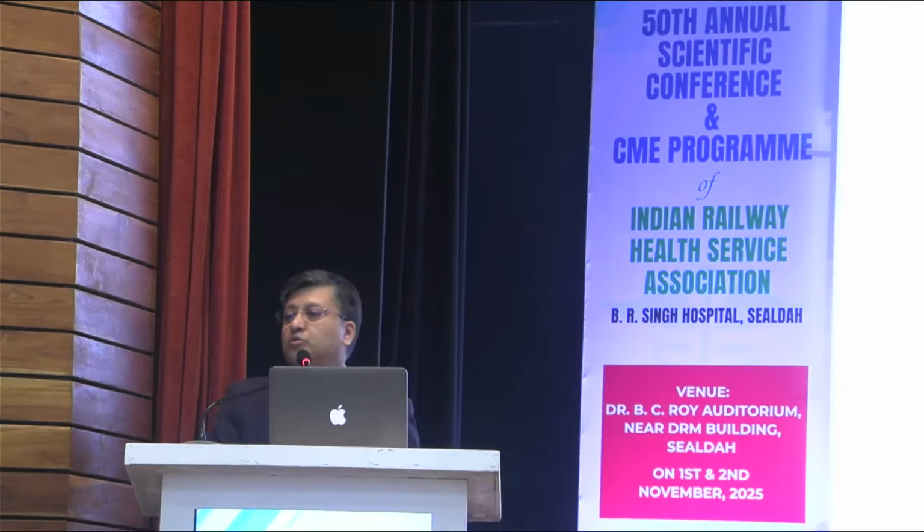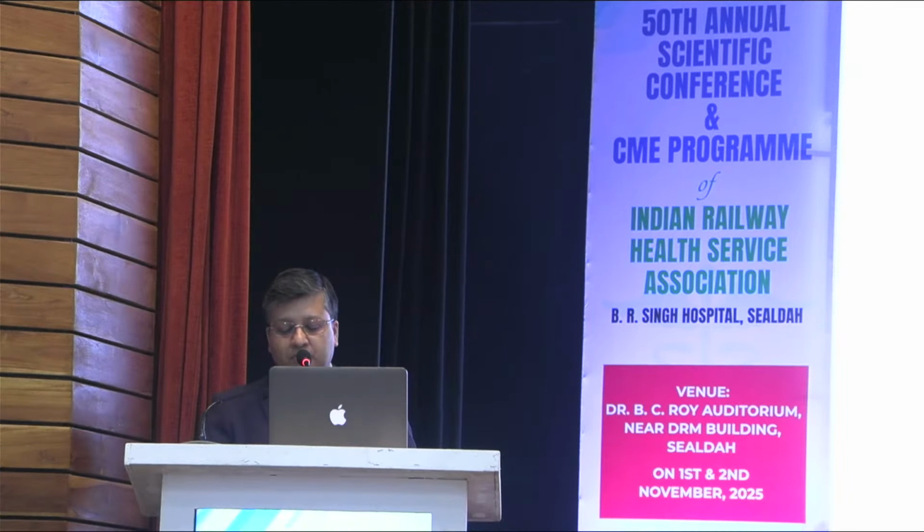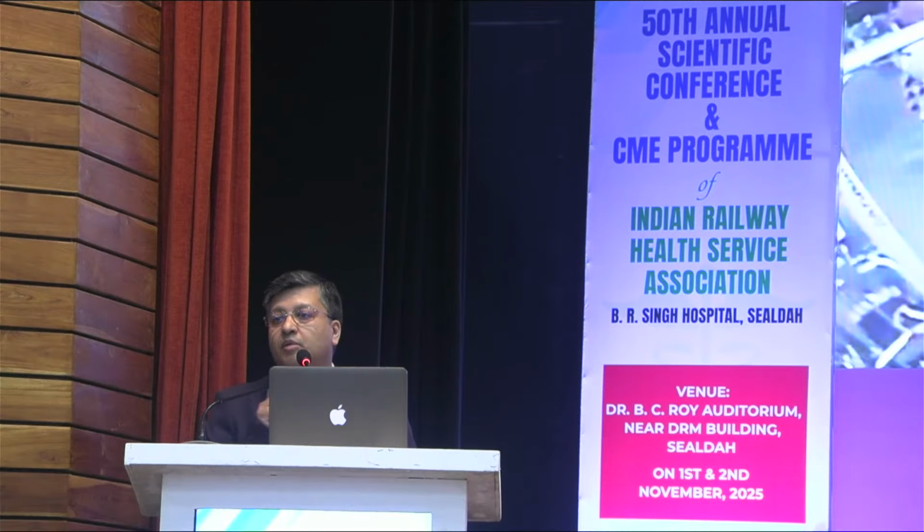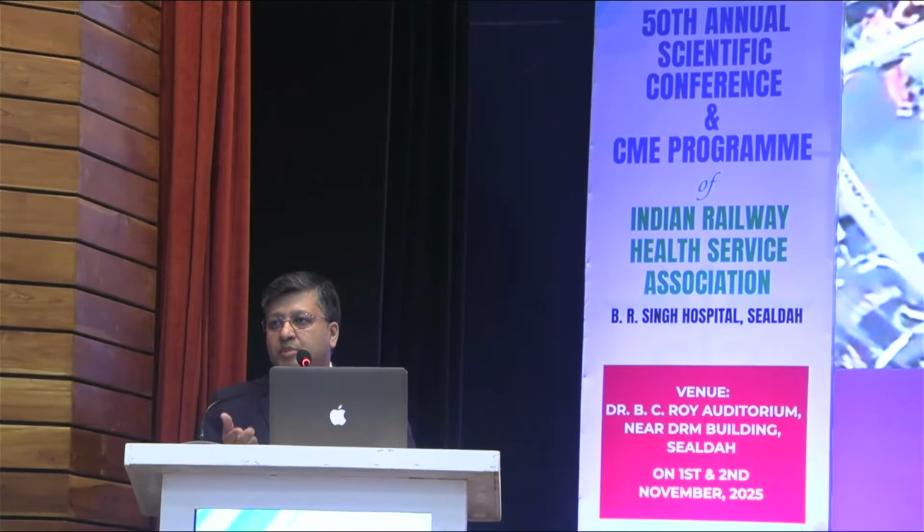Often there are no symptoms, and sudden collapse is the first symptom. Here you can see a very active person who is doing gym, and during gym this 35-year-old lady suddenly collapsed. Only CPR and an automated external defibrillator probably could save her. The automated external defibrillator is automatically charged and automatically discharged; you just have to attach the pads. It will automatically dictate what to do, when to stop CPR, when to start CPR, and by following its commands you can do it, and that is the lifesaver.